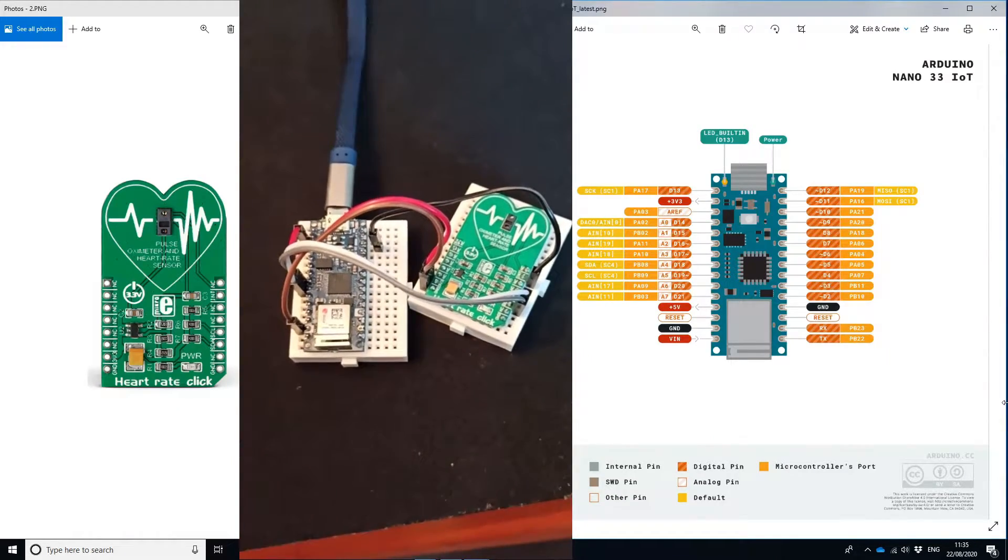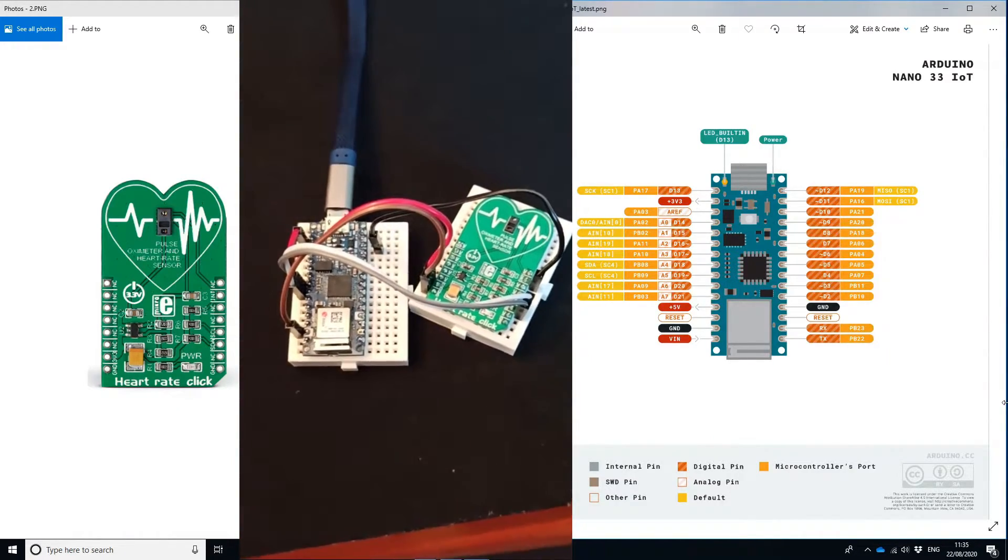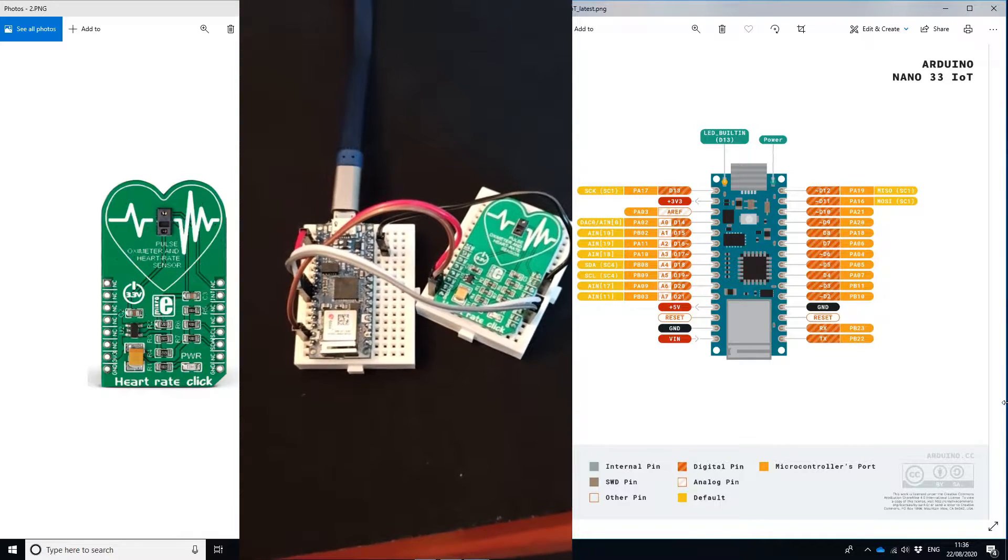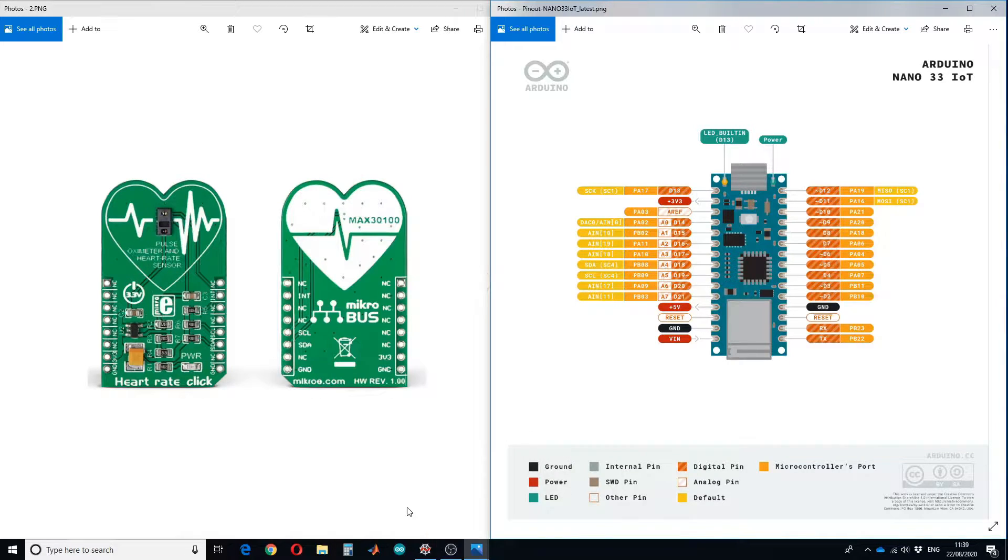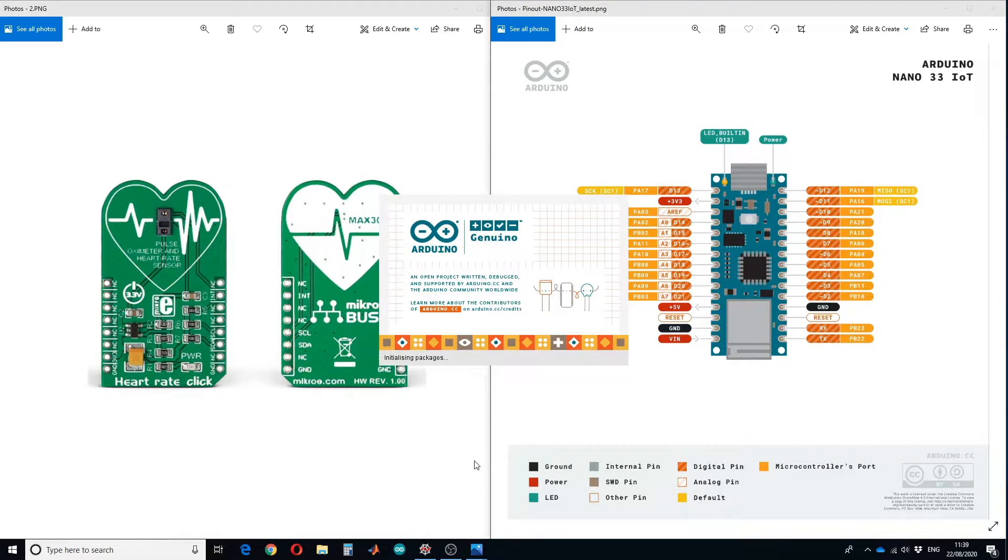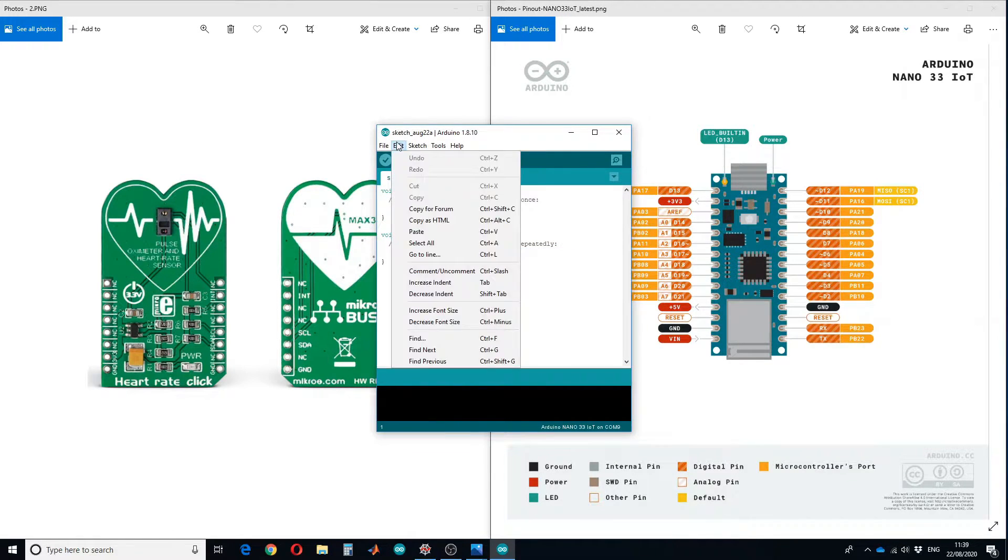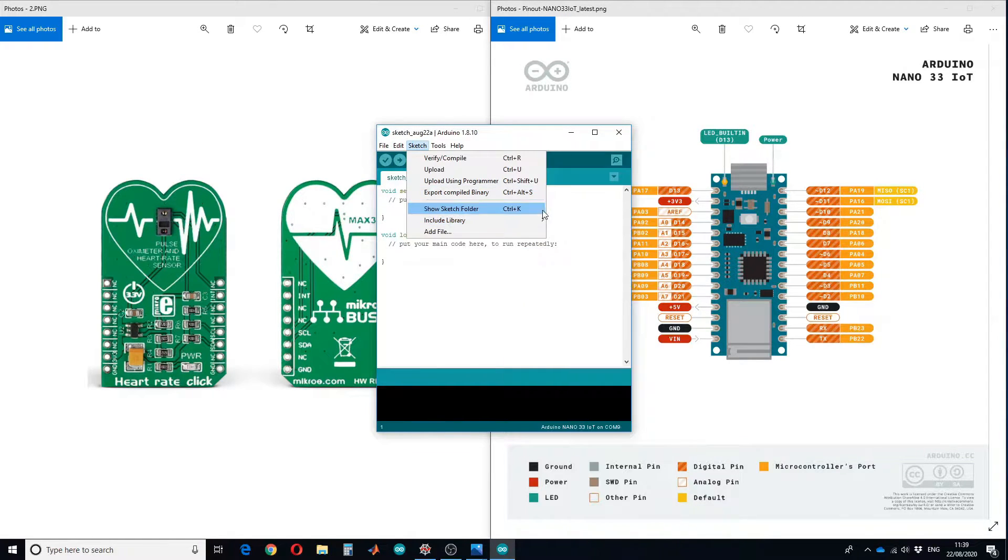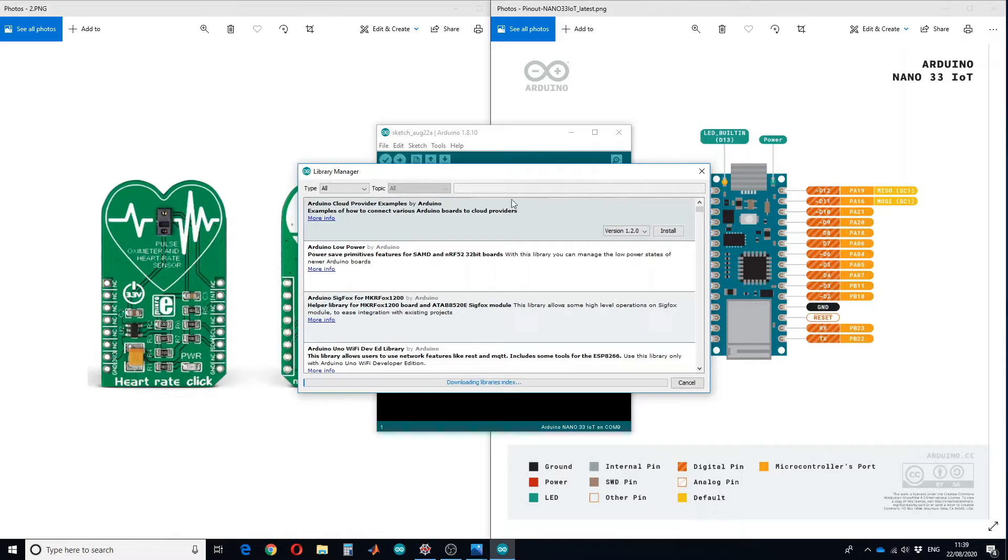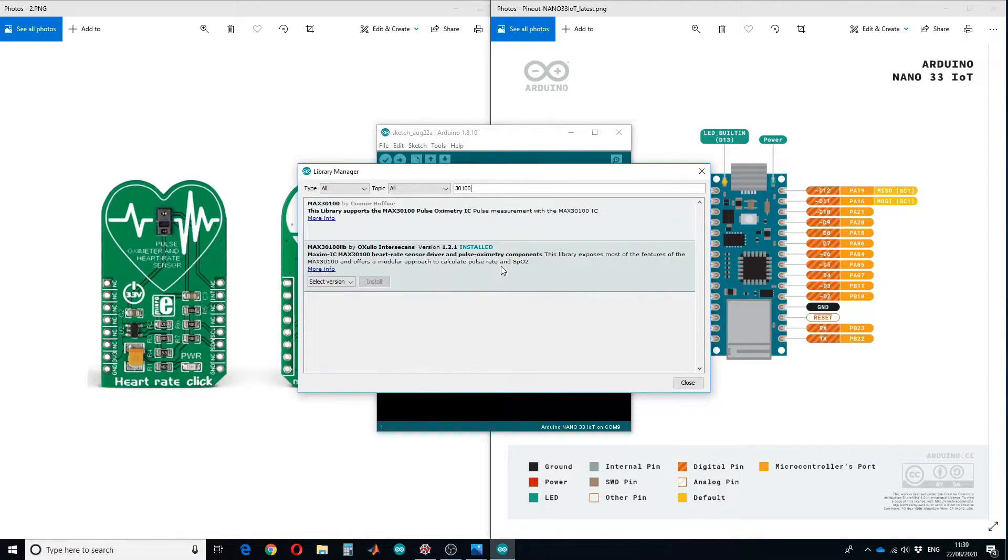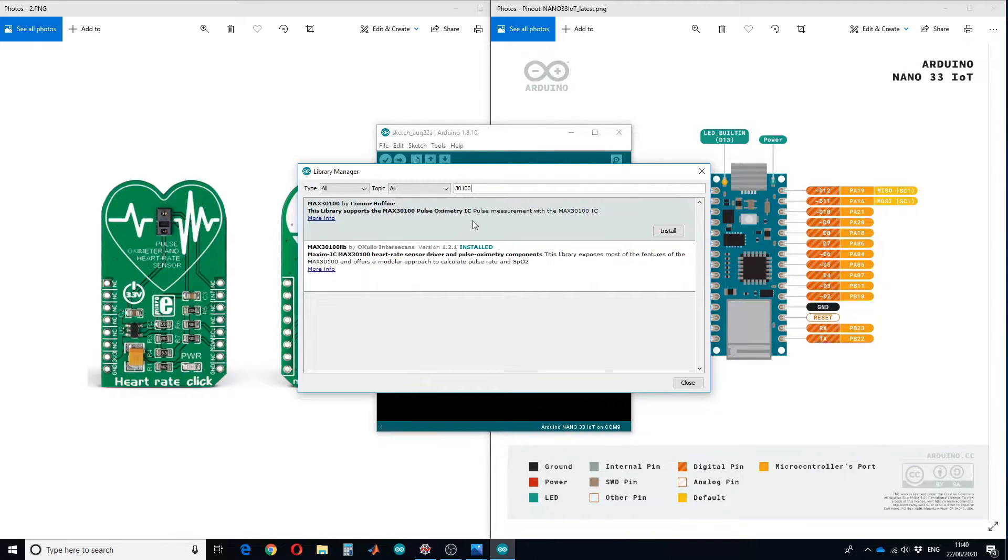All the connections are done, so let's move to the second step. The second step is to install the library. Go to Arduino IDE, go to library manager, and type MAX30100. You have to install the second library; the first one didn't work for me. I have already installed this.